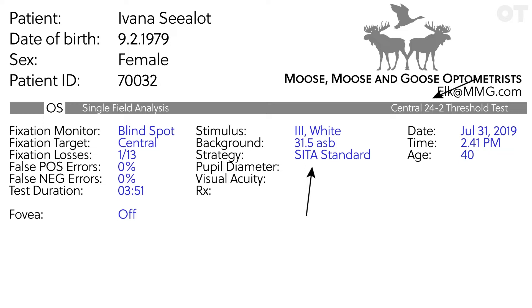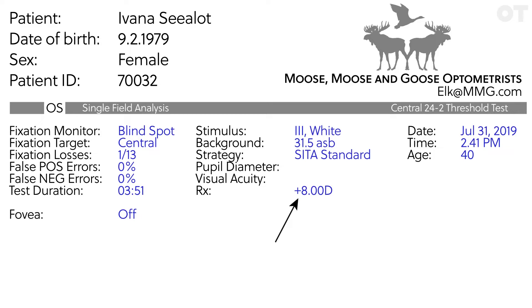Which eye are we testing? OD right eye or OS left eye? What refractive correction was used and is this appropriate for this patient looking at the bowl of this instrument for a prolonged period, at 30 centimeters?